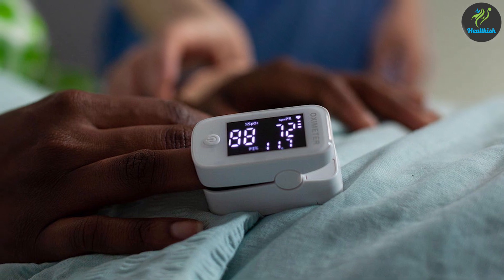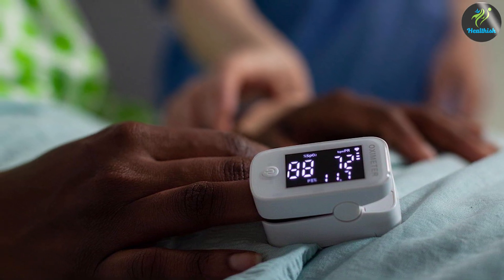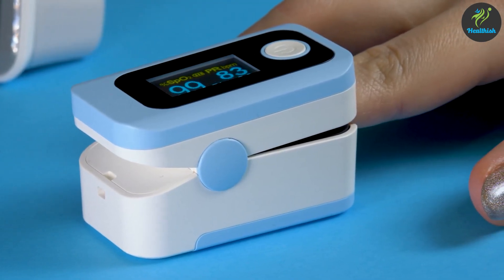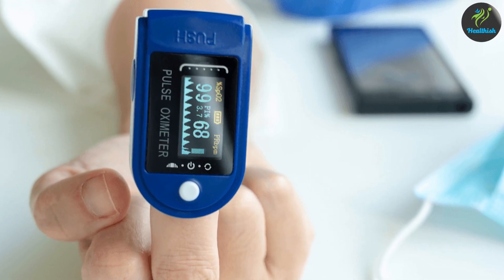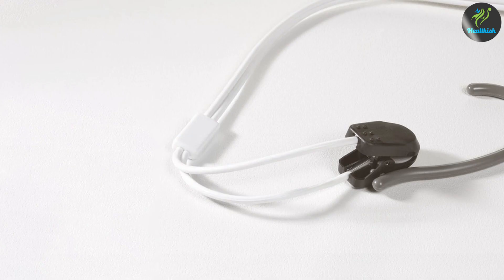Both ear and finger pulse oximeters offer reliable and convenient ways to measure blood oxygen saturation levels and pulse rate. Finger pulse oximeters are commonly used and easily accessible, while ear pulse oximeters may be preferred in certain situations. Consider your individual needs, comfort, and convenience when selecting a pulse oximeter that best suits you.